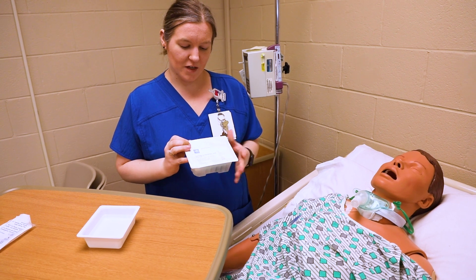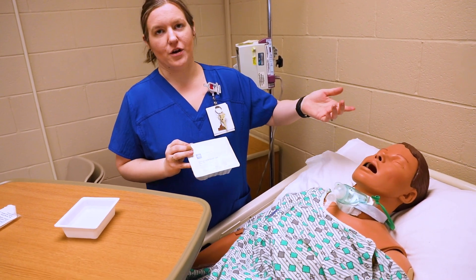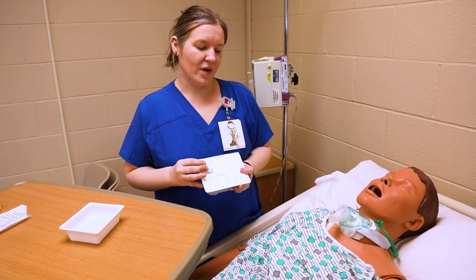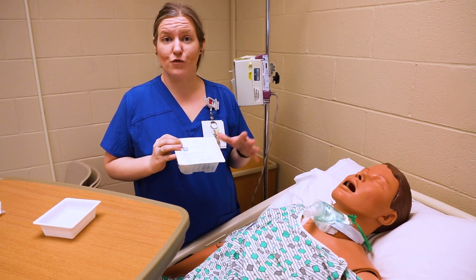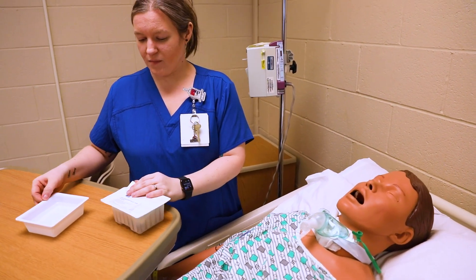I'm going to show you how to do an internal trach suctioning. If you're going to do oral suctioning or nasal suctioning, you can still follow this procedure a little bit. Make sure you also look at your policy and procedure, as I always say, and look at your course checklist to make sure that you follow all of those guidelines. This is just for a little reference.